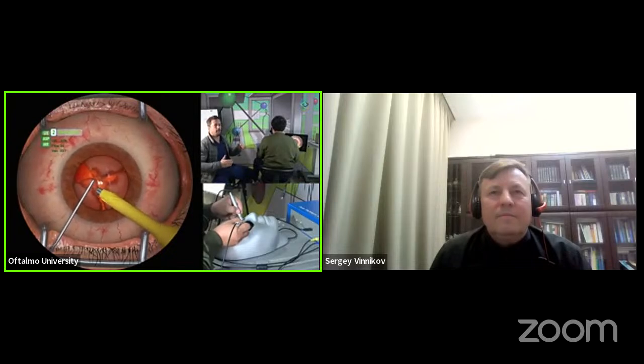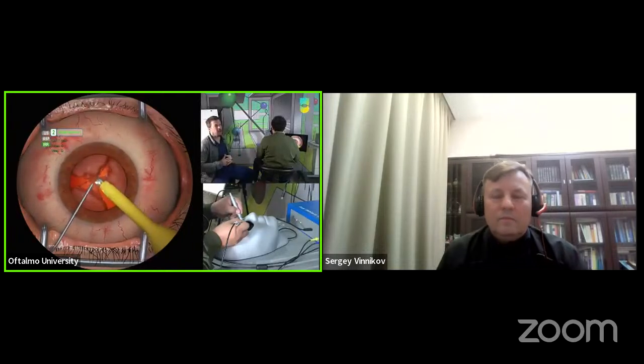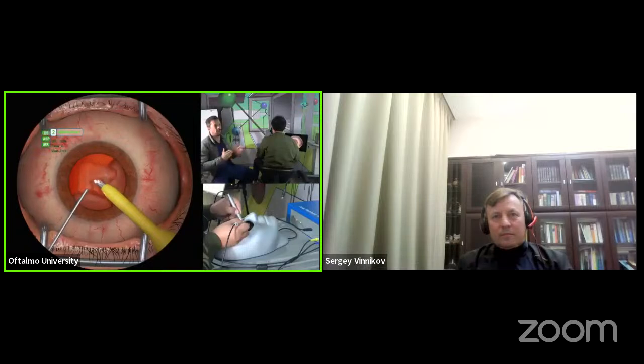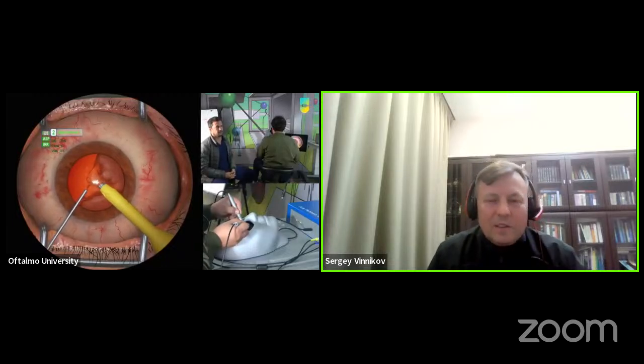And you need to make decisions in order to listen to the machine, see what's happening in that anterior chamber, and then be efficient with the energy you deliver. So this is one of the roadblocks. This is one of the bottlenecks when you are starting cataract surgery. That is to synchronize. Okay, I'll translate a little bit.